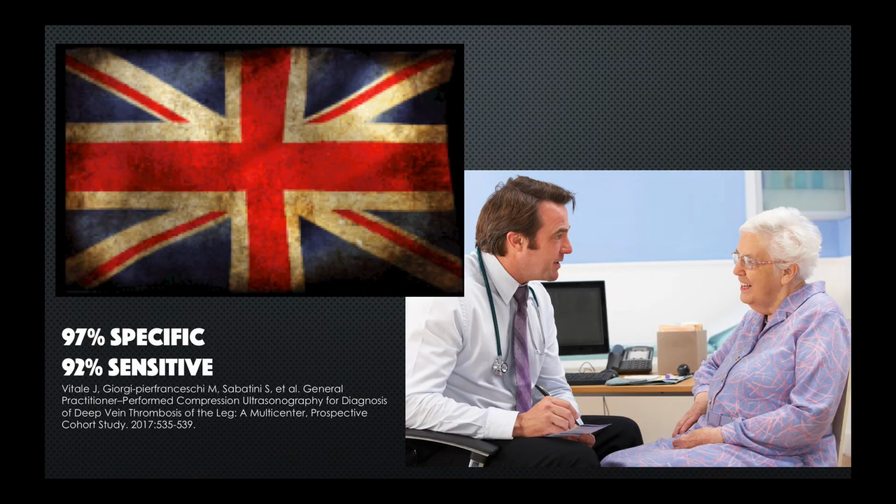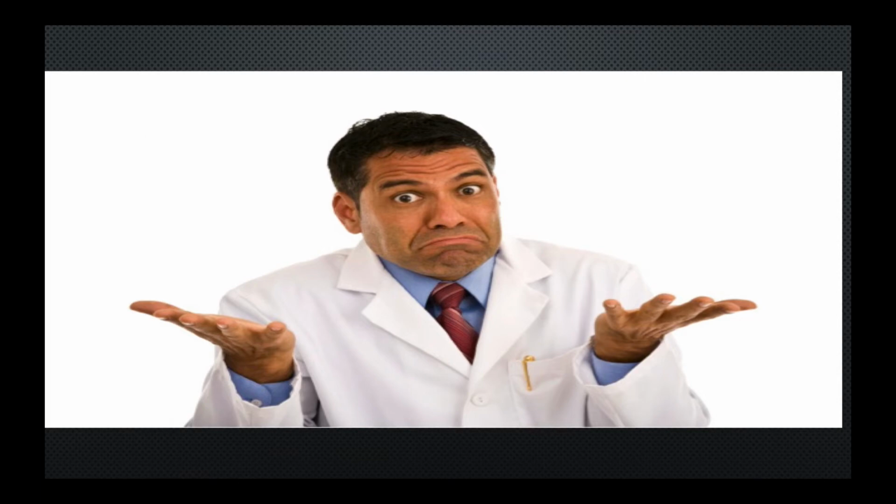More recent studies in the UK showed this was a viable option for general practitioners and family physicians who had difficulty getting radiology studies performed, if they went through a 2-month training process involving 16 hours of training. They had a 90% agreement with the radiologist performing a repeat study within days and were 97% specific and 92% sensitive. So the question is, how will this apply to your practice?